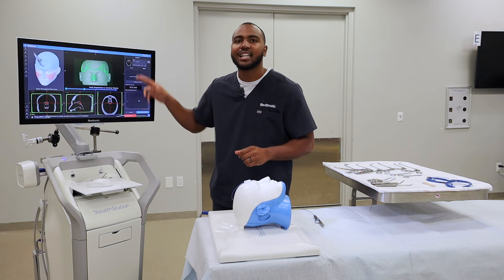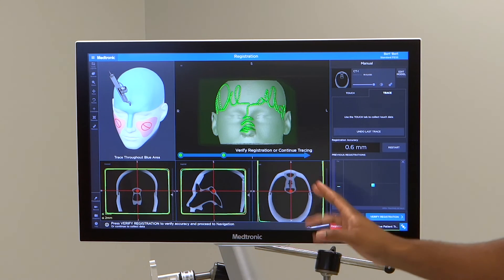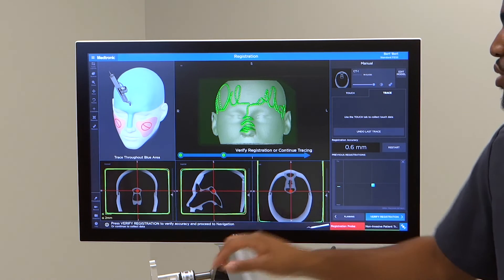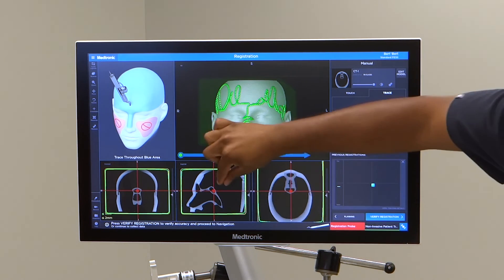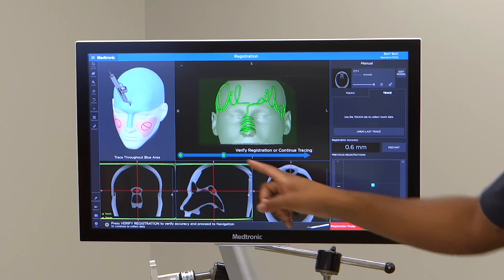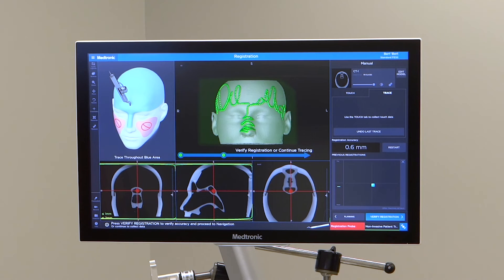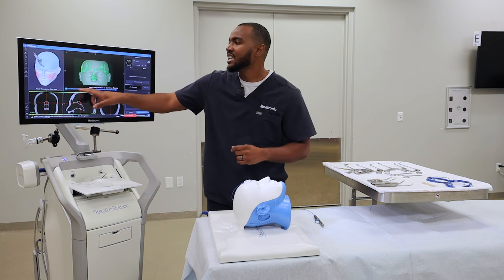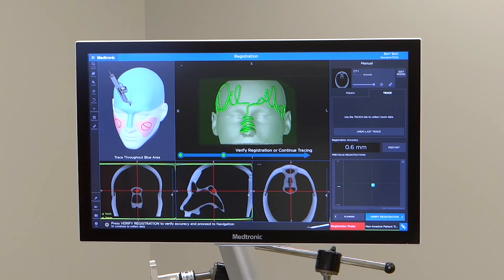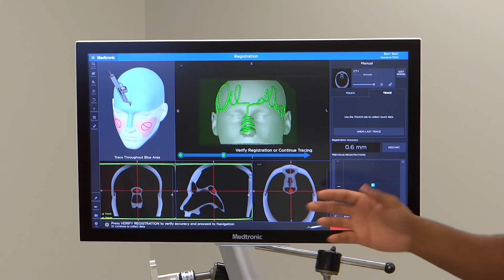The screen will stop lighting up white when you're finished. You'll have three different views: coronal, sagittal, and axial, plus a green circle. If you zoom in, you can also see a faint yellow line on the outside. The green circle means accuracy is at or below one millimeter, and anything inside the yellow circle is at or below two millimeters of accuracy. Ideally, you want that green circle over any anatomy you're operating in.